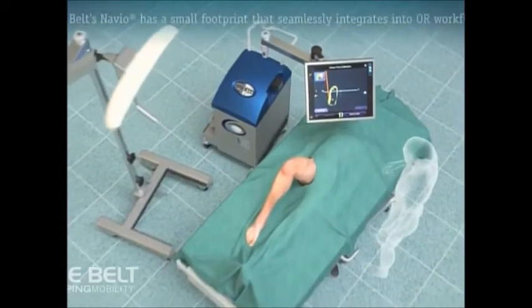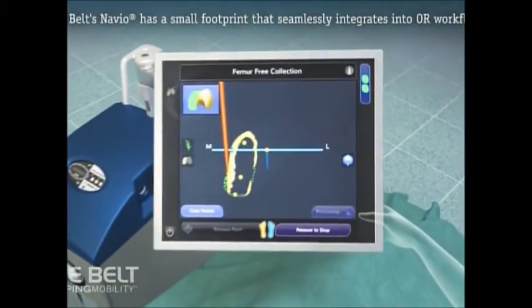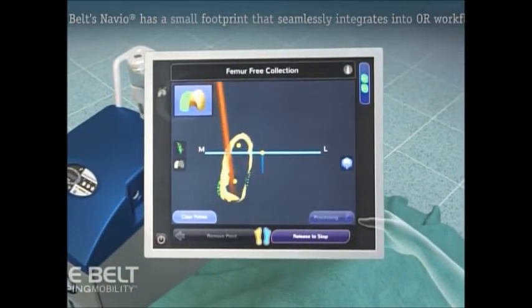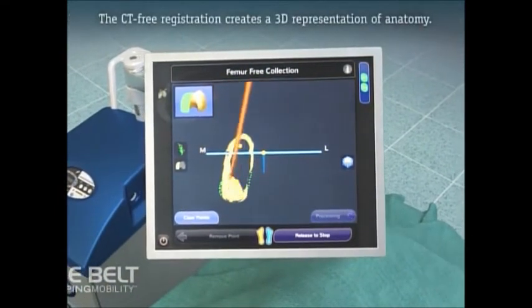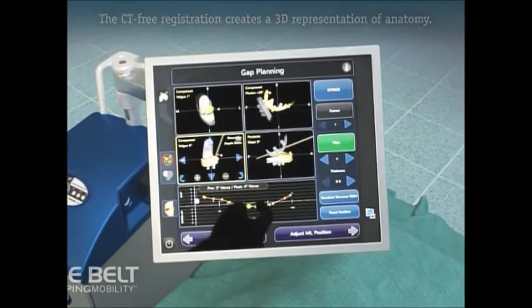Well, tell me about that. You mentioned the robot. When I was training, all they did was total knees, but now it's a little bit more sophisticated. Yes. The principle of this is, if only one part of the knee is bad, just replace that part. We have techniques with radiographs and special evaluations to determine whether you need a partial or a total knee. And if you need a partial, we can now replace it using this robot that you see here.